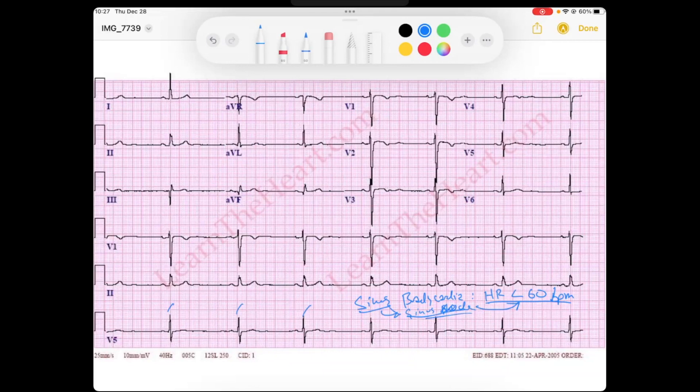If we want to determine the rate of this EKG, this R-wave on a solid line. We see 300, 150, 100, 75, 60, 50.